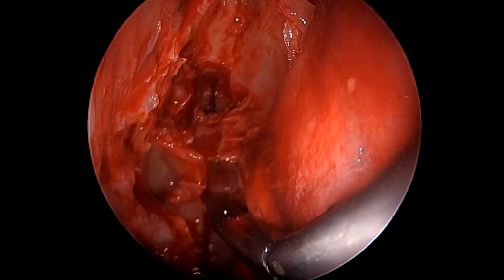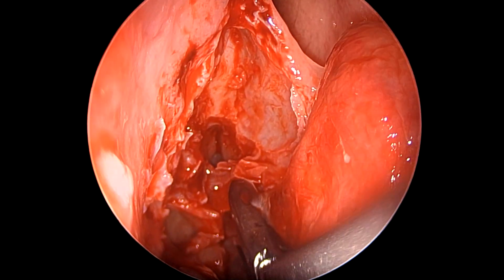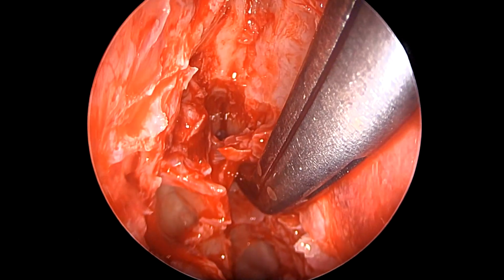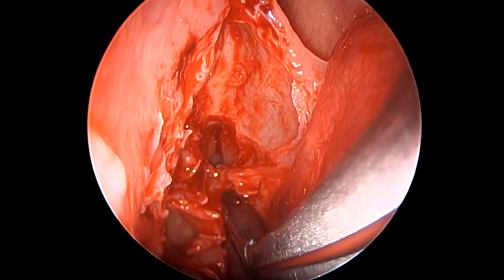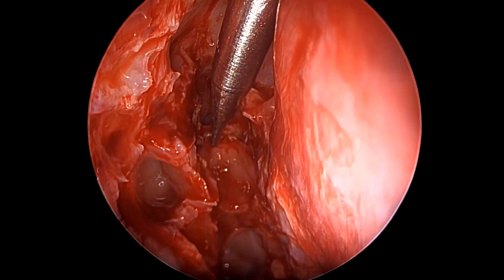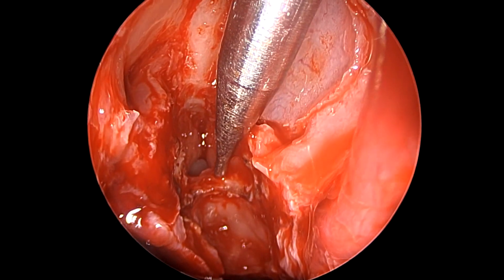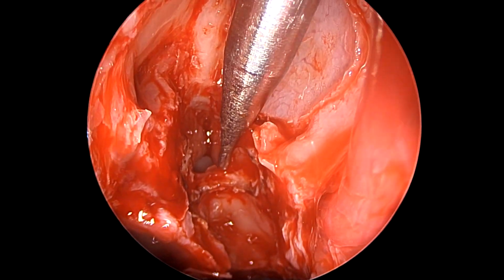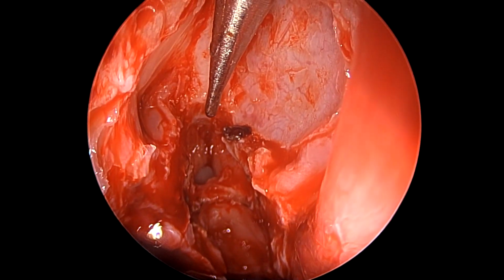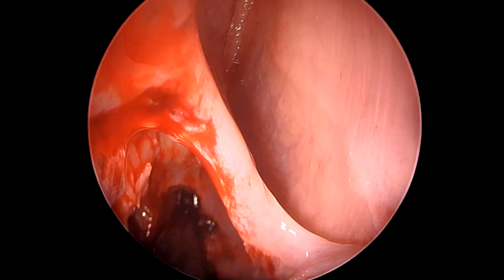Now we can very nicely see the entire skull base from posterior to anterior, with this small cell only impeding our way. This kind of curvature also reassures us as to what we are seeing. We can see the frontal beak anteriorly. We are seeing this cell which is now being removed. And we could see the entire skull base from the sphenoid onwards. Here I point with this navigator probe. This is approximately the level of the anterior ethmoidal artery, the one that was previously touched. And this is the frontal beak. This is the tip of the frontal beak.